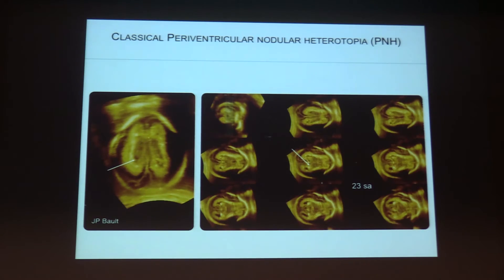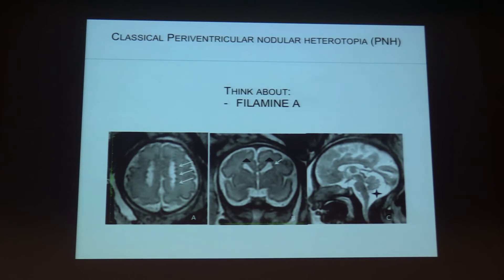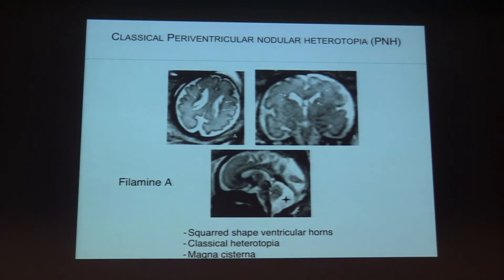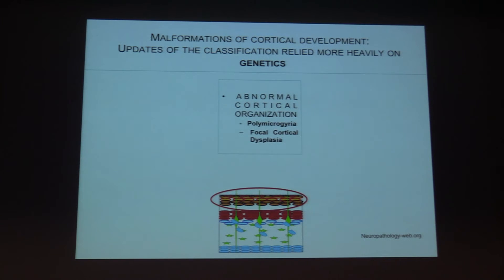You can have heterotopia — this particular aspect with little nodules in T2 hyposignal lining the ventricle. When you have this squared aspect of the ventricular horns and an enlargement of the posterior fossa, you must think about the filamin A mutation. But once again, the most important thing is not to make a definitive diagnosis but to correctly recognize all morphological anomalies. Here is another example of heterotopia.